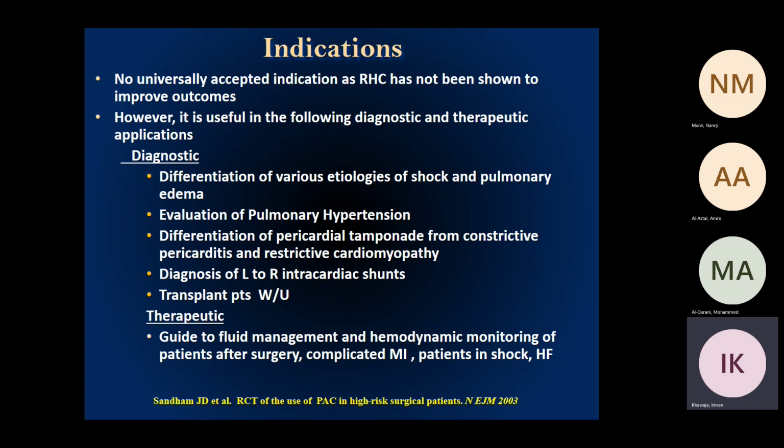You can look at the indications under two categories. It can be done for diagnostic purposes, mainly for patients with pulmonary edema or shock that you are unable to categorize or differentiate based on clinical evaluation, so the Swan-Ganz might help in that respect.